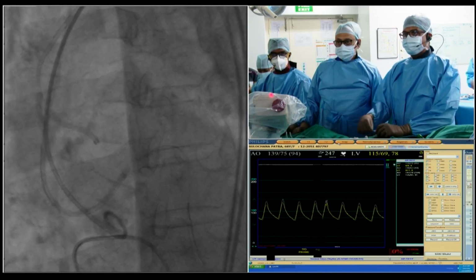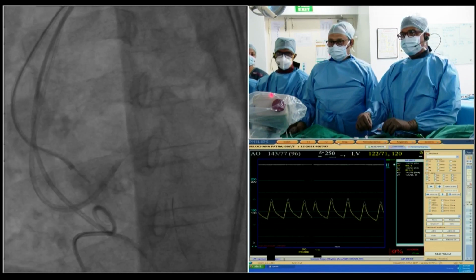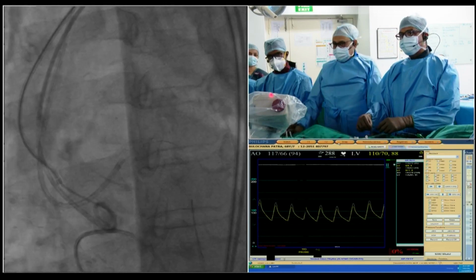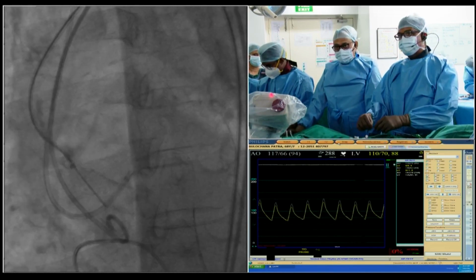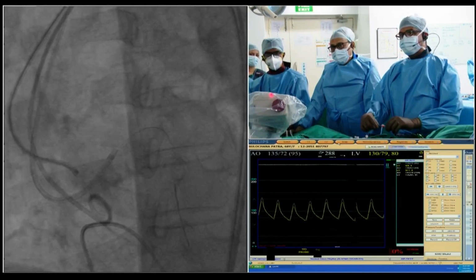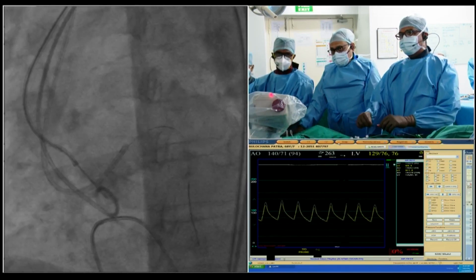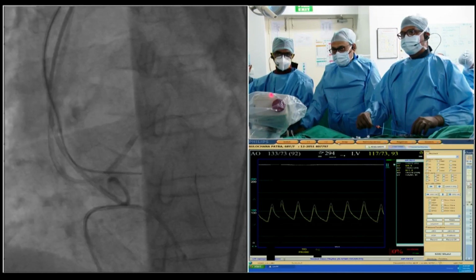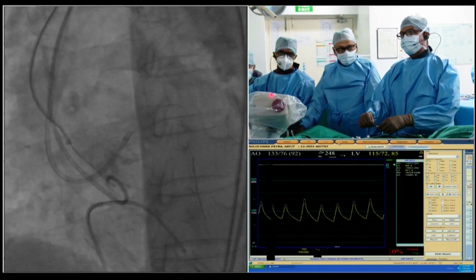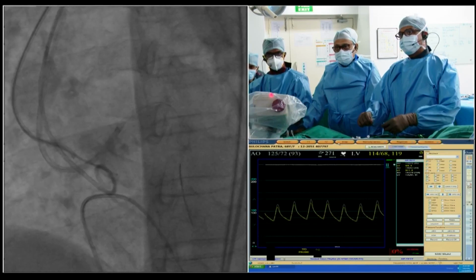Why specifically the balloon expandable valve here? Because of the coronary heights and coronary access. It's easier to do a chimney, or it's easier to do coronary protection with a low height valve, which is balloon expandable valves, compared to a self-expandable valve. And Anil, we must realize if you try to do a deeper implant to protect the coronaries, it comes with a price, we may end up with a pacemaker in a patient who has got pre-existing RBBB. Very bulky and calcified leaflets.